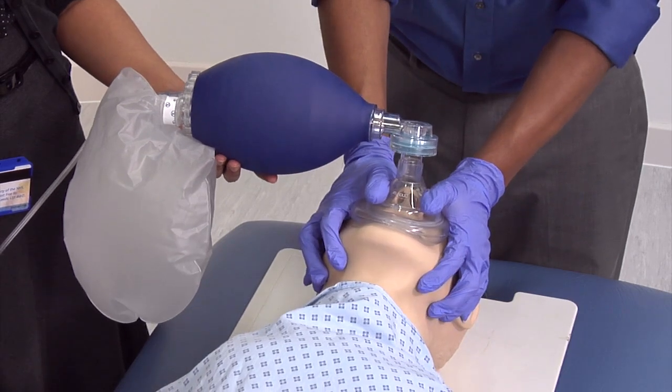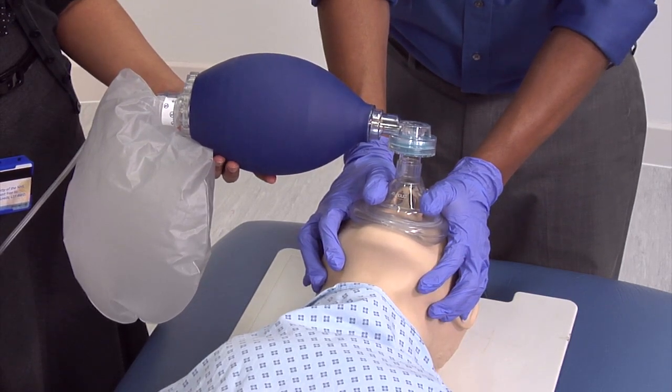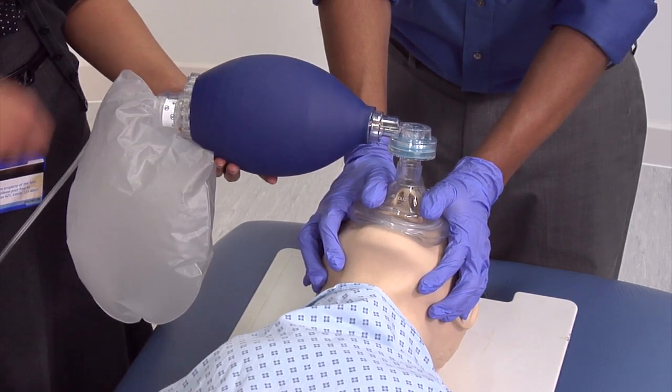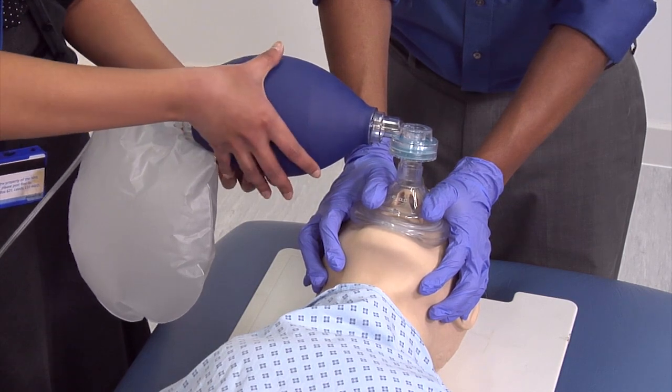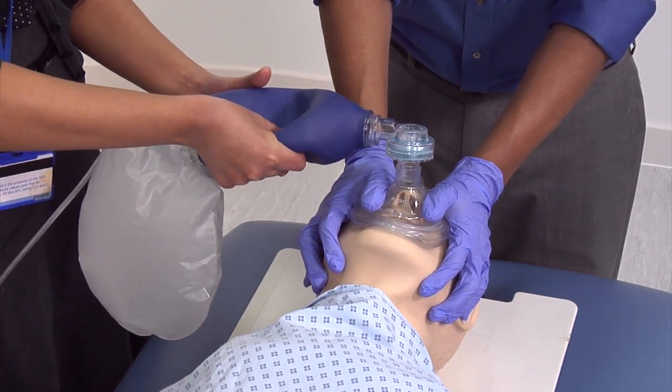The second clinician should squeeze the bag fully every five seconds to achieve a respiratory rate of 12 breaths per minute.